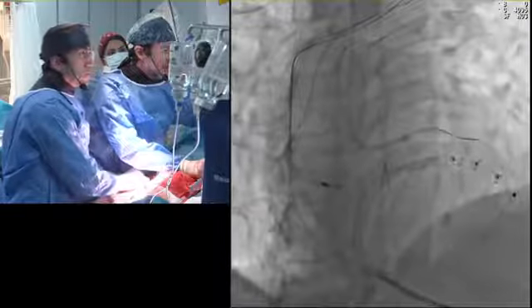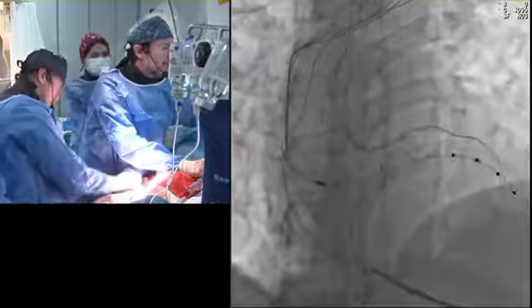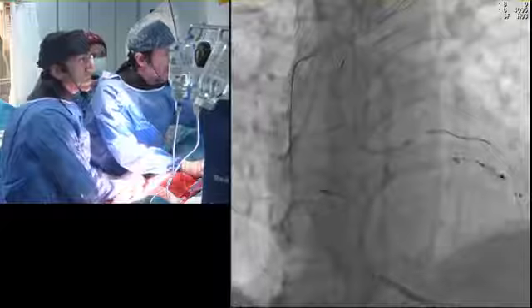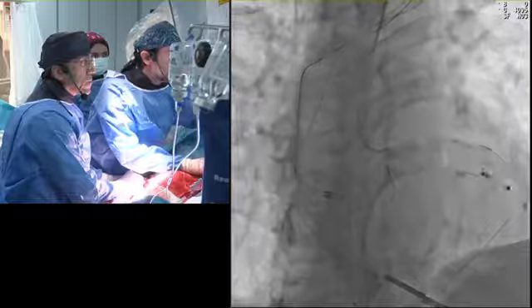Yeah, Carl, the problem here is it's very difficult to push the RG3 through the microcatheter. I know. So it's squeezing. That's why I think the R350 is better actually. Ben de R350 var çantamda ya. Okay, I will change to the R350 because I want to go out. I don't want to have this friction. So I don't like this friction here. Yeah, okay. Now try to capture it. So I will change with the R350.